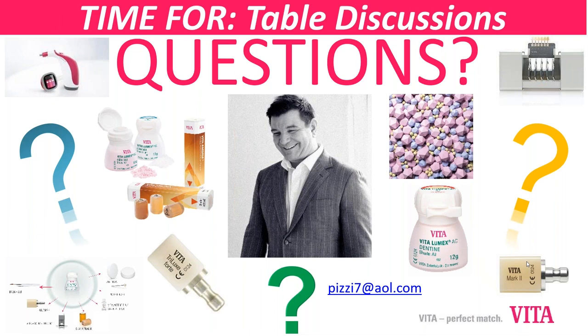So another question is, have you fabricated veneers out of zirconia before? I mean, there's a tendency, we're getting more buzz out there, people starting to use zirconia for veneer work, but I have not for a few reasons. One, optically, let's be blatant and say zirconia, lithium silicate, and disilicates are good materials, but optically, they're not the greatest materials for light. We have to kind of manipulate them, stain them, colorize them, change them, or layer them to really make them do something somewhat aesthetically useful.